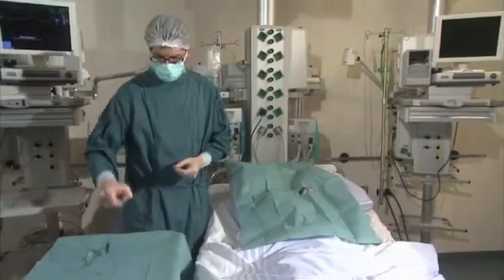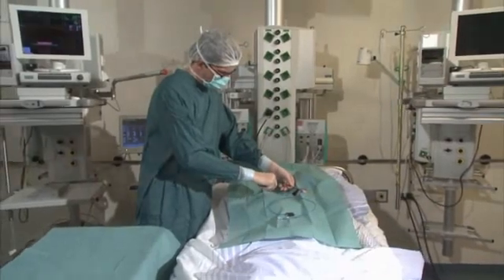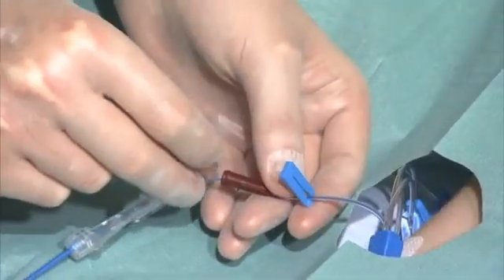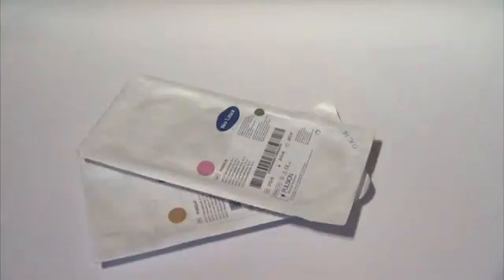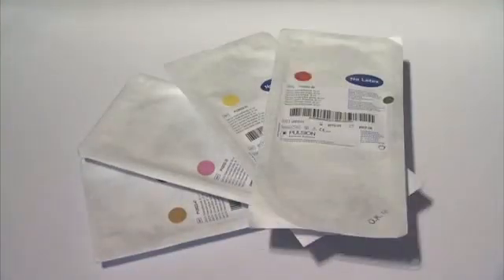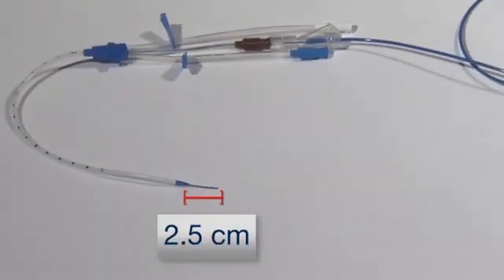Placement of the CeVOX probe is quick and uncomplicated. It is advanced through the distal lumen of a central venous catheter. A central venous catheter that is already in situ can be used. CeVOX probes are produced in a variety of different lengths. Prior to introduction, the correct length of the CeVOX probe must be determined. It is important that the tip of the probe projects 2.5 centimeters beyond the end of the CVC.